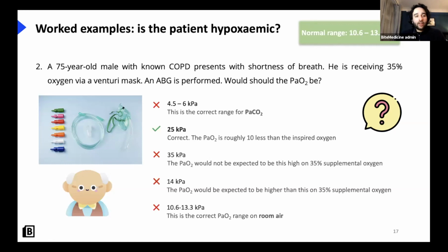The flow rate varies by the color. So for example, blue represents around 2 to 4 liters of oxygen per minute, and that is equivalent to 24% oxygen. That's just an equivalence that we've calculated here, and it actually says it on the actual bit there.